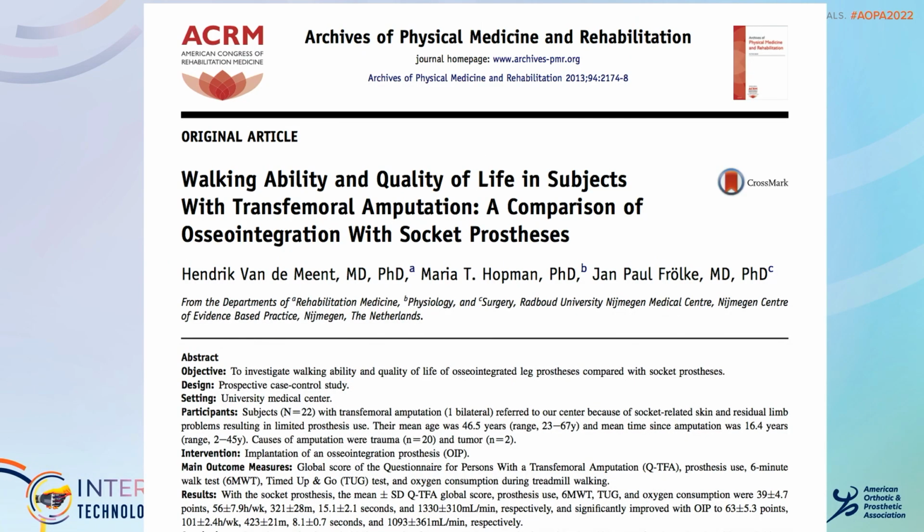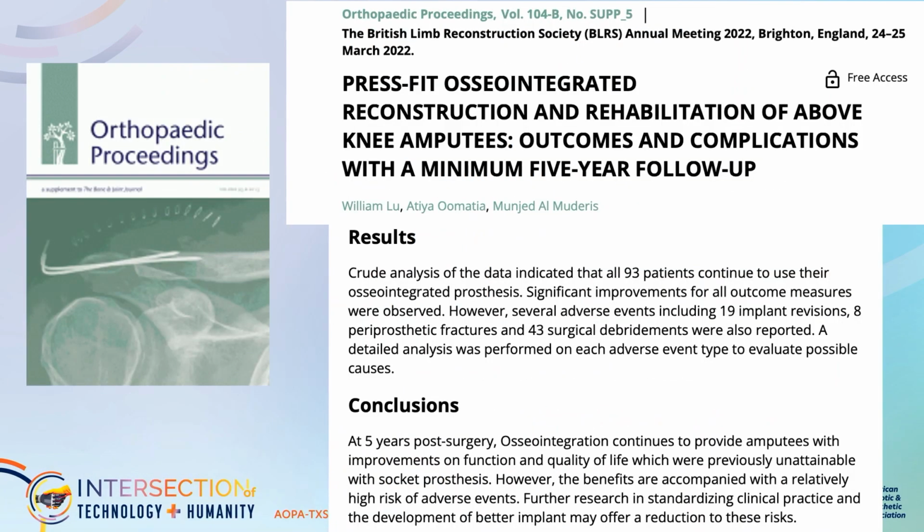But what about other kinds of studies? We oftentimes use the 6-minute walk test or maybe the timed up and go test. This is a study from the Dutch team that shows the 6-minute test, the timed up and go test, and even the percent of amount of oxygen that you use are better and improved compared to a traditional socket for above knee amputees. In other words, an above-knee amputee that has osseointegration uses 18% less oxygen, less energy for every step that they take. That's a significant difference in why people are raving about it that wear that.